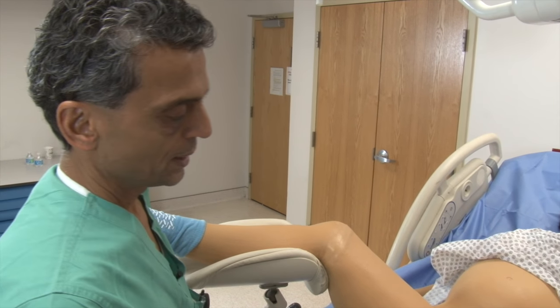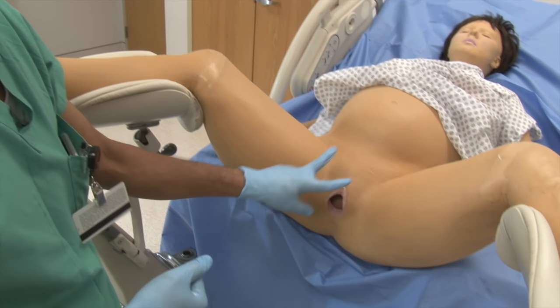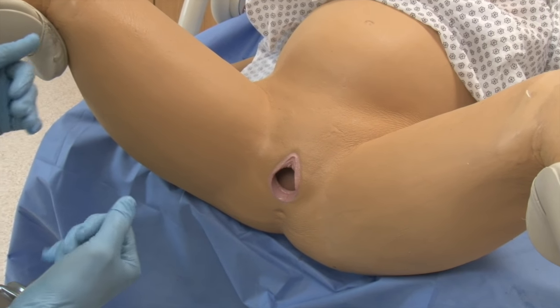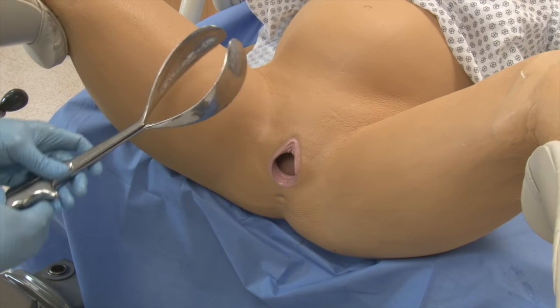We're going to do a simulation on application of forceps. Mom has pushed baby down to plus two station. Baby's LOA and mom's exhausted, so she needs some assistance for a forceps operative delivery.